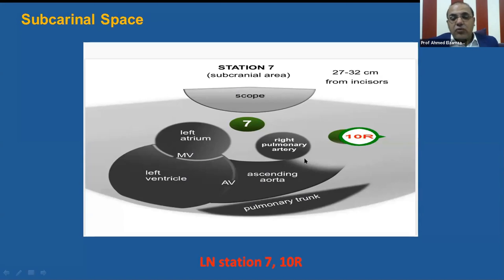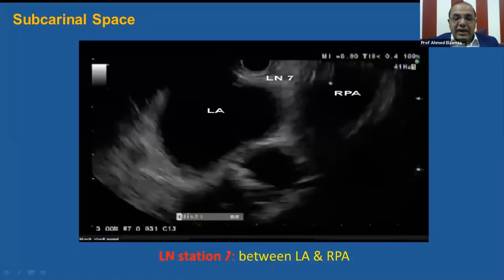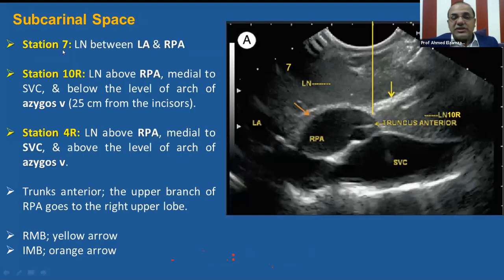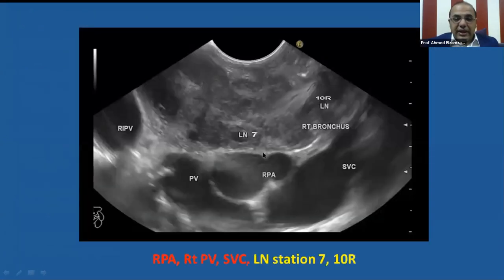When we withdraw the scope more and more, we can find lymph node station above the right pulmonary artery, medial to the superior vena cava — this is station 10R. Again, this is the left atrium, right pulmonary artery, and lymph node station 7 in between. So station 7 lymph node is between left atrium and right pulmonary artery, while station 10R is lymph node above the right pulmonary artery, medial to superior vena cava, below the level of arch of azygous vein. Station 4R is lymph node above the right pulmonary artery, medial to superior vena cava, but above the level of the arch of azygous vein. This is the right pulmonary artery, superior and inferior pulmonary veins, superior vena cava, and lymph node above the right pulmonary artery medial to superior vena cava — this is 10R.